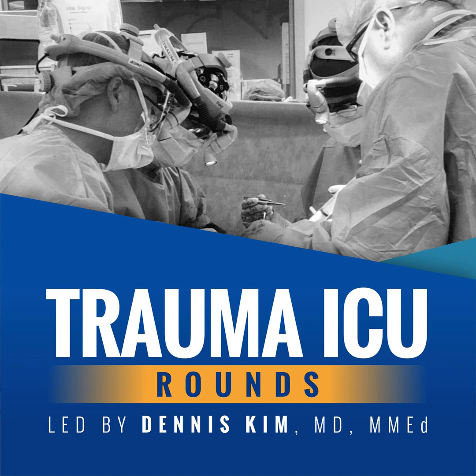So that now brings us to our third objective, which is to describe the four phases of a mechanical ventilator breath. And these four phases are: number 1, trigger; number 2, the inspiratory phase; number 3, cycling; and number 4, the expiratory phase. So let's talk about each one of these individually.